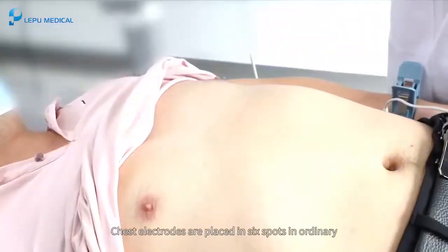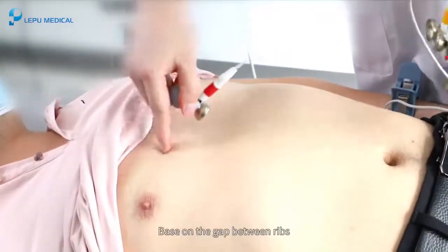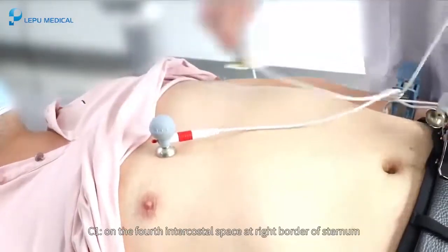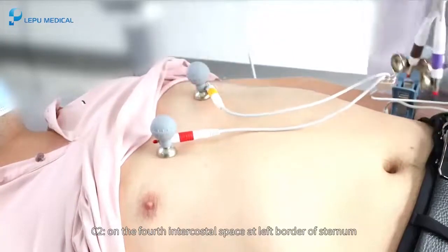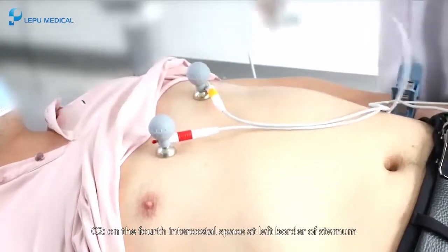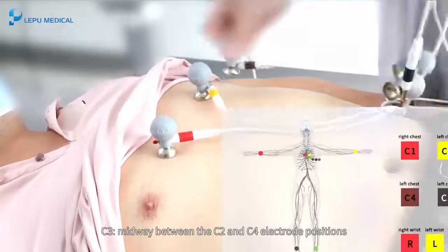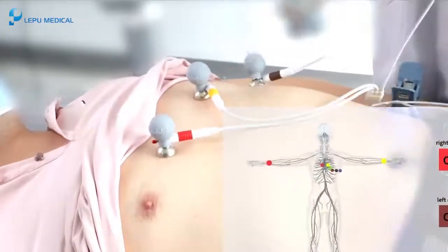Chest electrodes are placed in 6 spots in general, based on the gap between ribs. C1, on the 4th intercostal space at the right border of the sternum. C2, on the 4th intercostal space at the left border of the sternum. C3, midway between the C2 and C4 electrode positions.